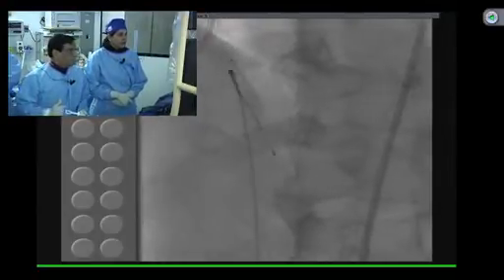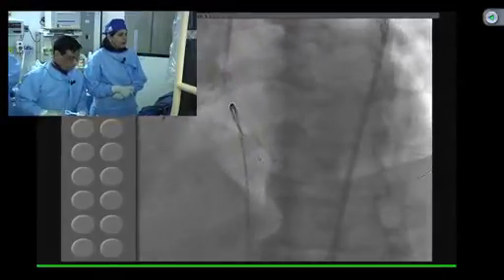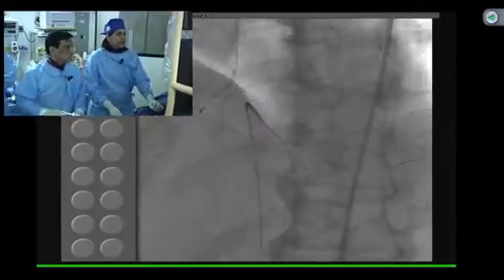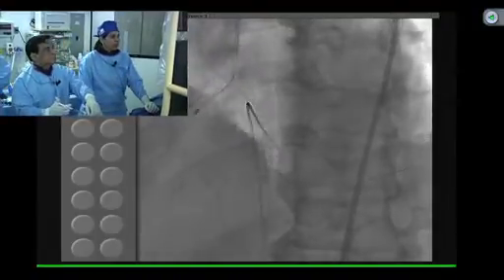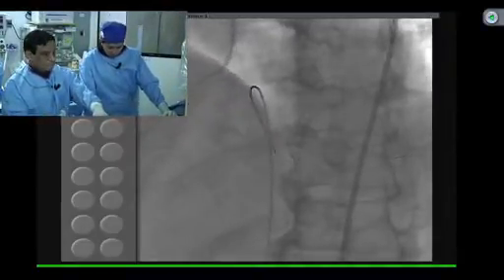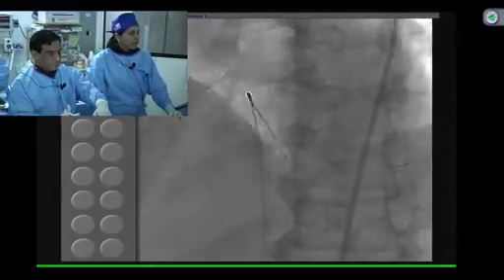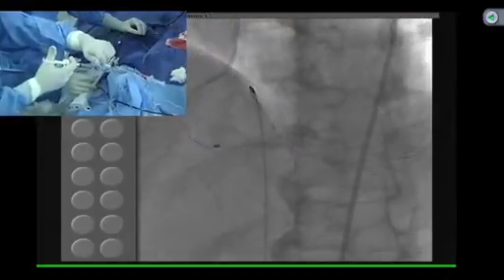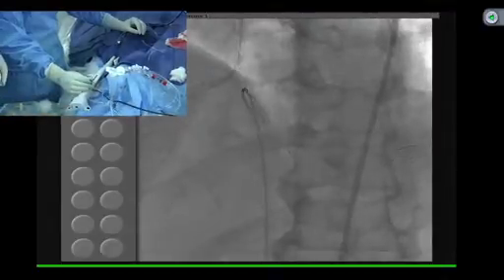Yeah, that's what we want to do, but what I am predicting is that when we are reaching the distal RCA, this burr might give us trouble, since it took me at least 5 passes to get into the true lumen, through the stent struts into the PDA. Now the question is, we do one more run here with the rota, and then how do we get the burr to the distal RCA? We have to use the Dynaglide and get the burr there. So this is a smooth pass.